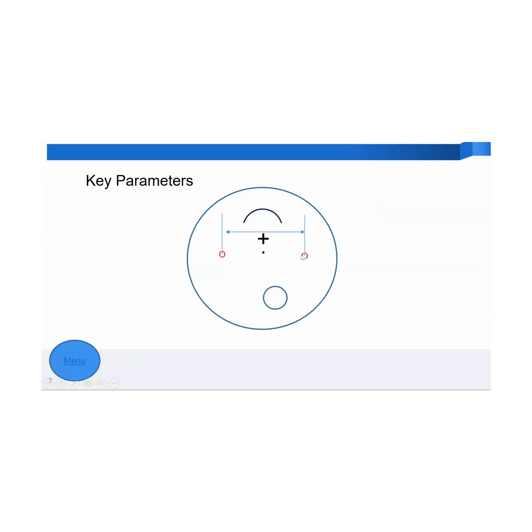Fitting cross, your micro engravings. The distance between micro engravings is 34 mm, right? Fitting cross to prism reference point depends on the manufacturer. It can be 0, 2 mm, 4 mm, 6 mm. And then your prism reference point to the center of the reading circle, this generally is called inset, and this happens to be at 2.5 mm.